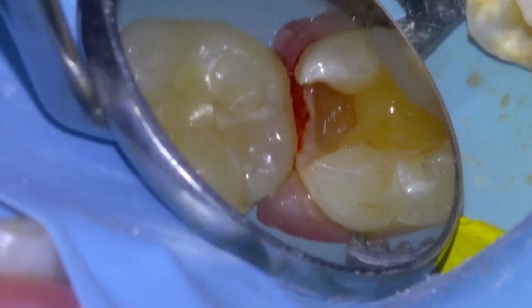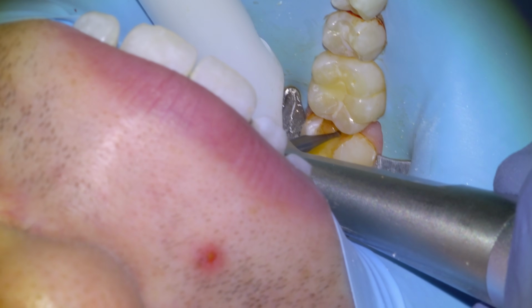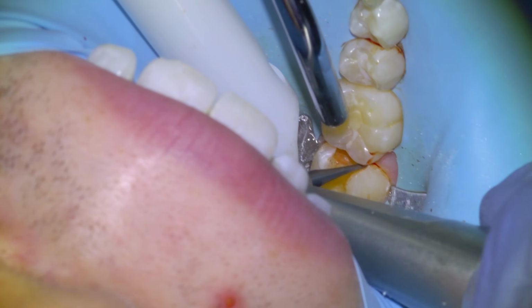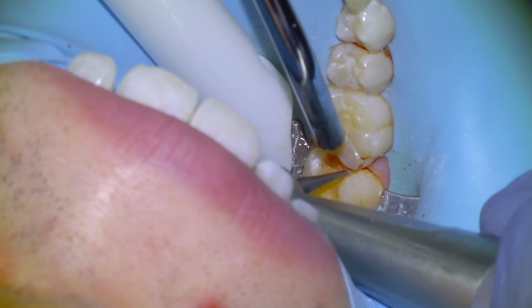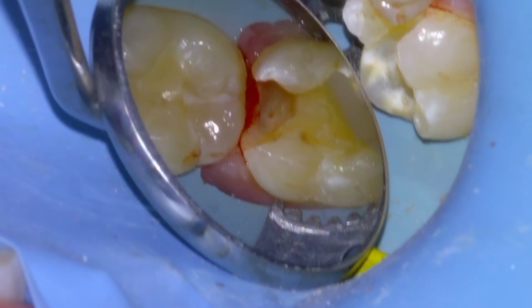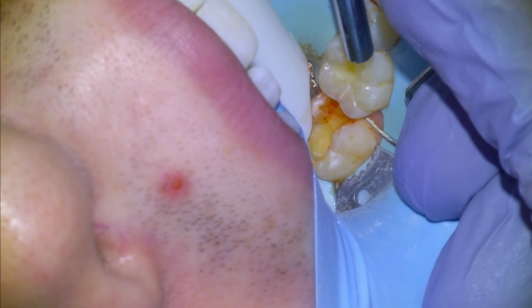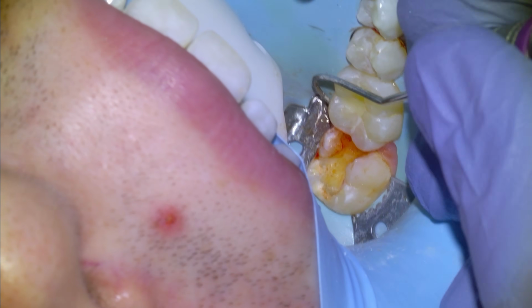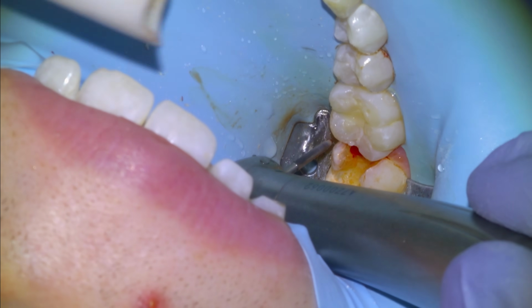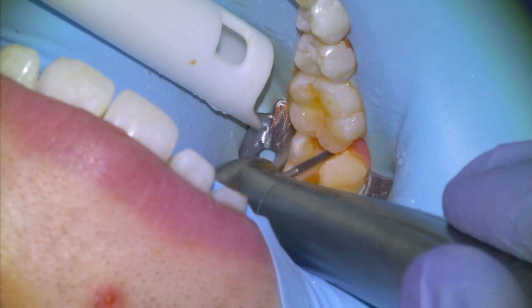We can see still some caries in the lingual aspect of the prep, so we're going to go back in and continue excavation with the small carbide burr. And we can still see a little bit, just a touch, on that lingual aspect of it. I'm going to open up the contacts here with an explorer, and then actually I'm going to go in with a carbide flame burr just to kind of round off any enamel chips.